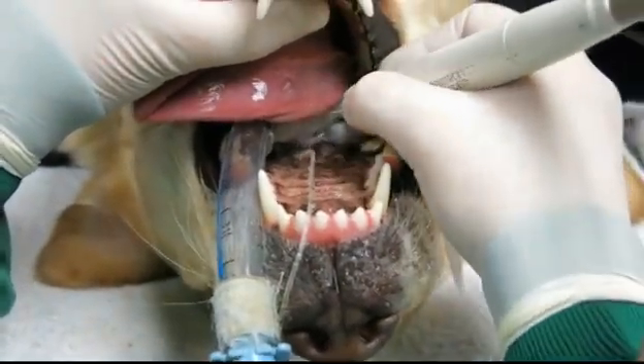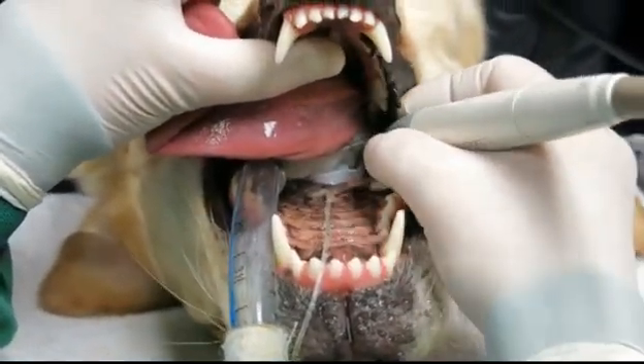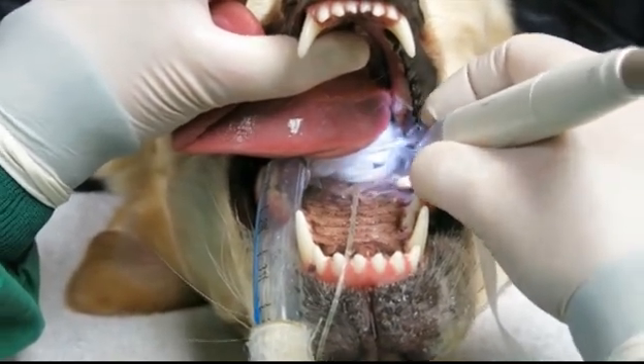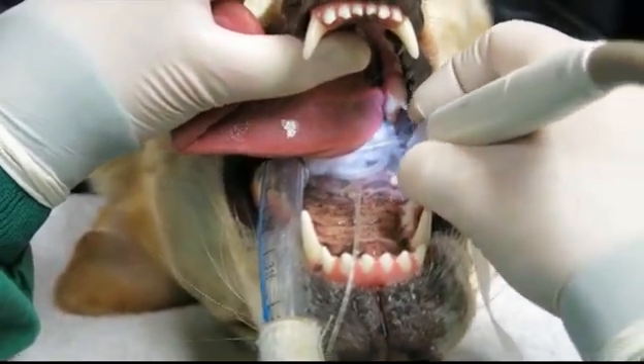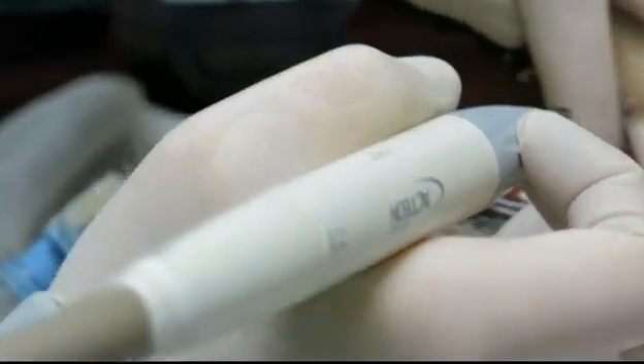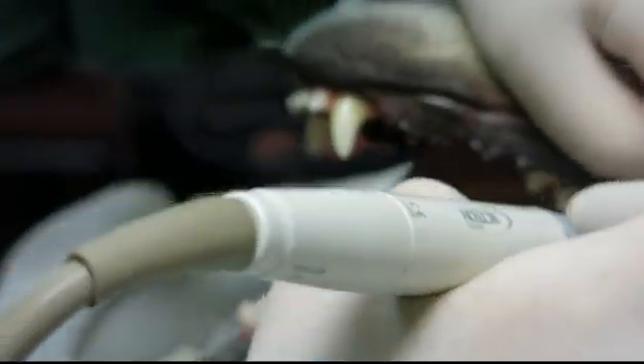The gauze at the back is to stop any tartar chunks going down through the trachea and into the back of the mouth. I've had a look at the x-rays and it looks like we've got stage 1 periodontal disease. This is when you really want to be doing this.